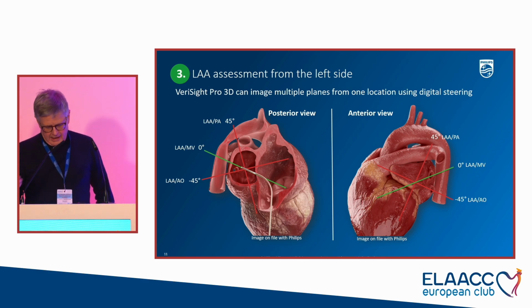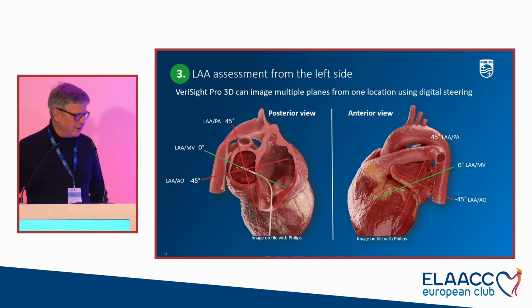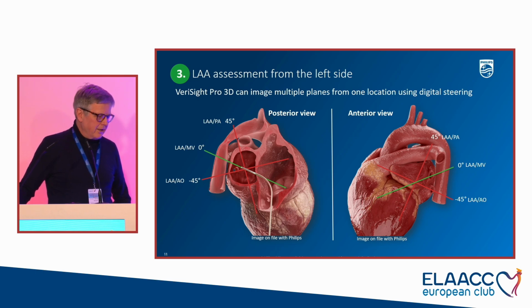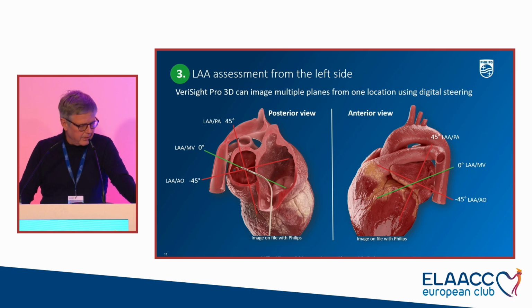It has, as it is now, developed so that we can guide left atrial appendage closure from the left atrium. There was this question, can we just stay in the right atrium and get everything from the right atrium? And I don't really know. Probably image resolution is not that good, but it's still something that we need to explore, the possibilities with this new catheter. Can we really stay in the right atrium and maybe have sufficient information? I don't know as it is now.